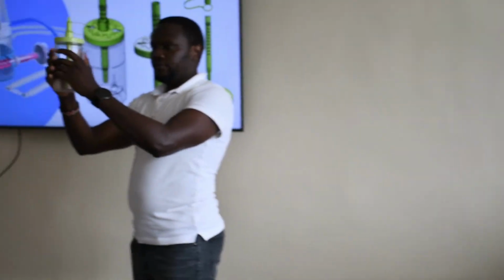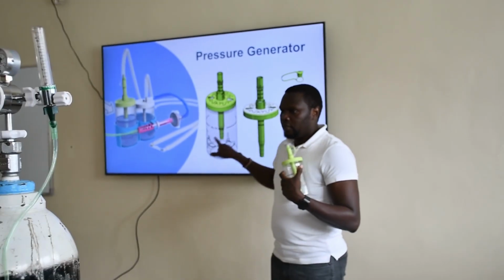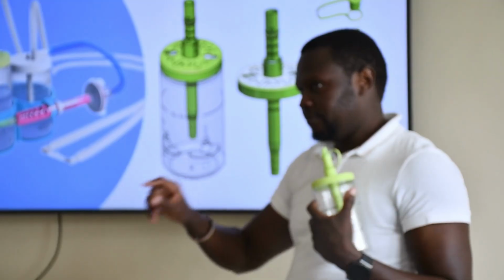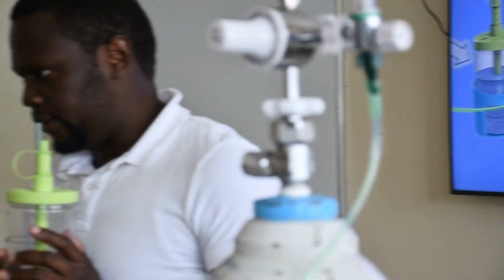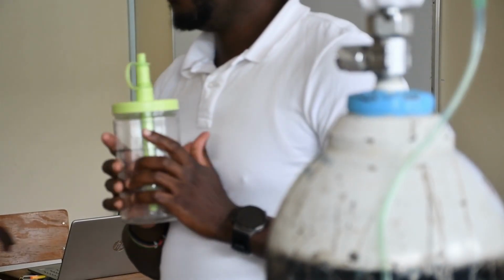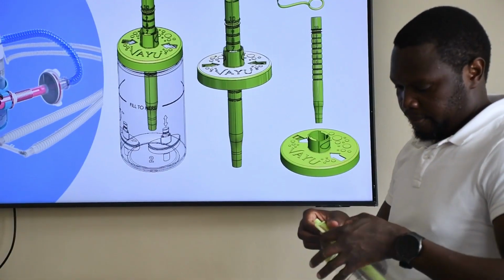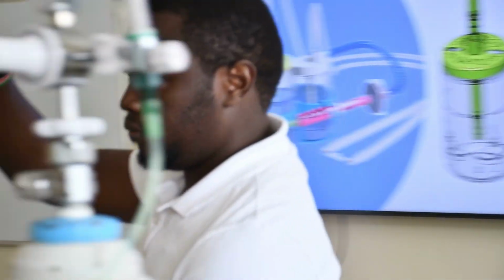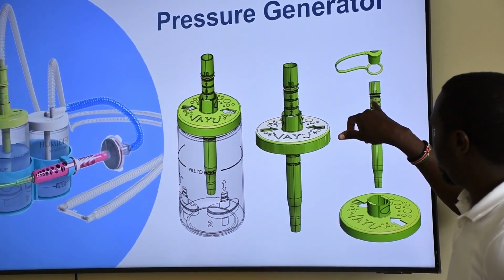Okay? So the bottle has, the bottle itself, to this lower part, it only has one line, fill to here. Remember that had two lines, this only has one line. Okay? So fill to here, meaning that your fluid content here must always be this line. Always. Okay? Why must it always be there? It's because, as we see, we have this one, okay? In a straw. So, this one is calibrated from 4, 5, 6, 7, 8, 9, and 10.